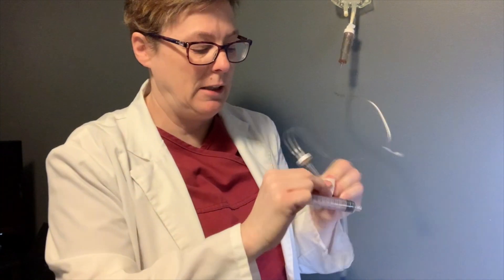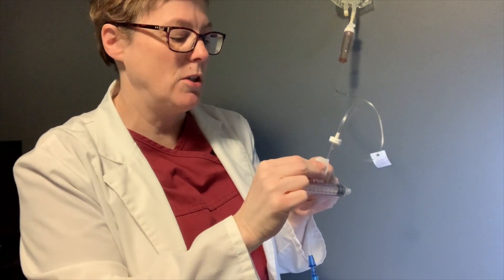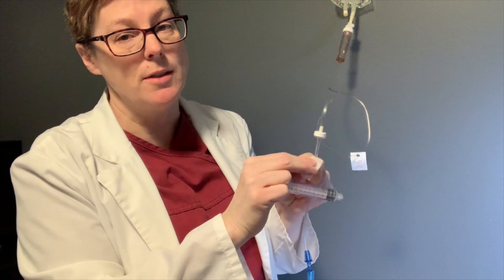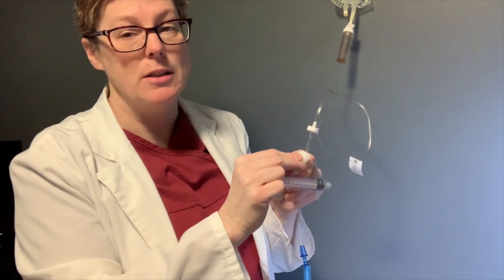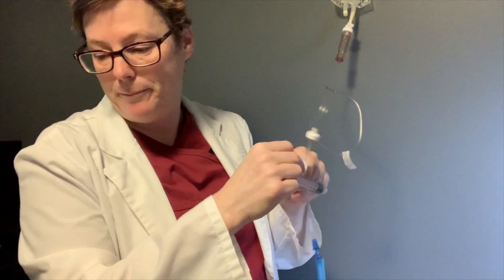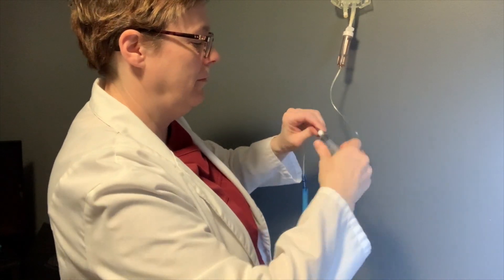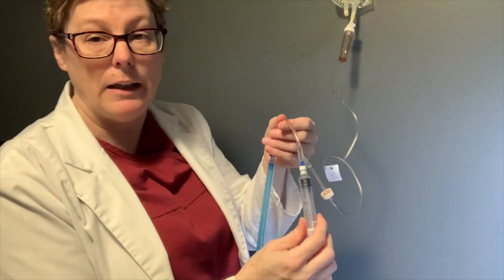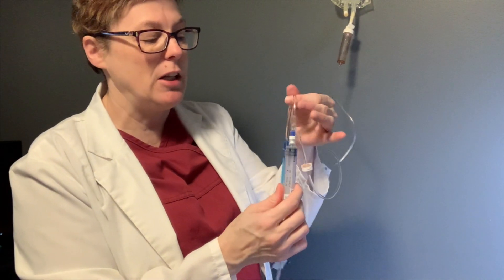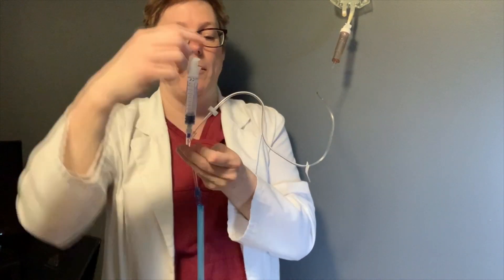We're going to do our cleaning — a 15-second scrub to make sure we are reducing the risk of any microbes being introduced when we attach our sterile syringe. Even though the syringe is sterile, we still want to clean the hub. Now we're going to screw this on. The other important piece is you need to clamp below the port, so that the fluid this syringe is going to pull is coming from above and grabs that air bubble.